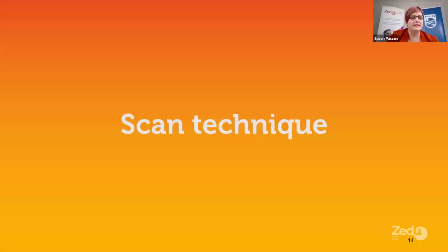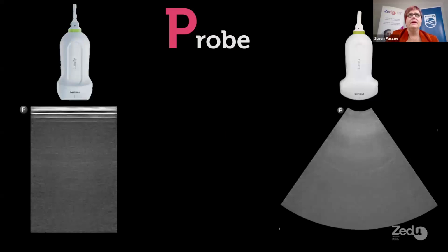So let's have a look at the scan technique. The first step is to choose the right probe for the job. So the linear probe is, of course, the best probe. It's high frequency, very good for near the surface. Now the testicle is only about 3 or 4 centimeters wide, and so the linear probe is good for that near field resolution. The problem is the width of the footprint here; a lot of the time the adult male testis just doesn't quite fit within the length of the probe.